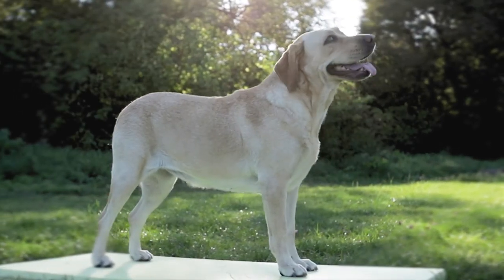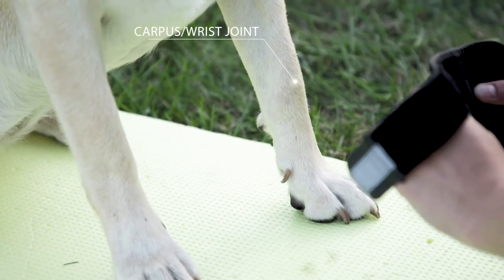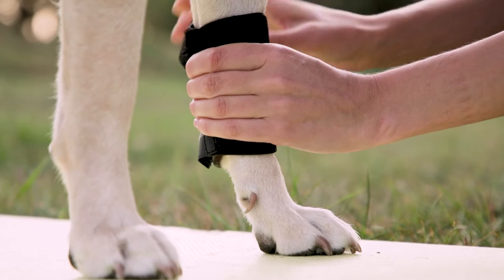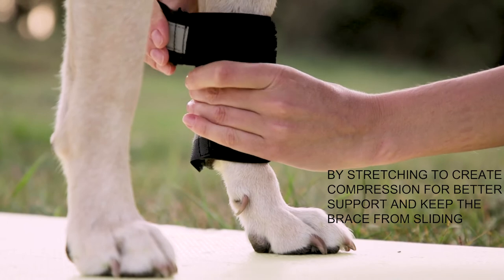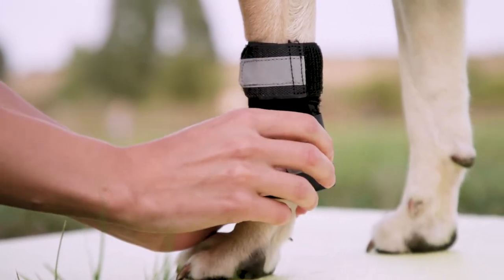Vets strongly recommend wearing braces on both legs. With your dog sitting or standing, wrap the left brace on the left leg above the foot. Cover the carpus or wrist joint. Make sure the two metal spring strips are on each side of the leg. Stretch the brace, tightly wrap around, and fasten the top strap first, then stretch and fasten the bottom strap.